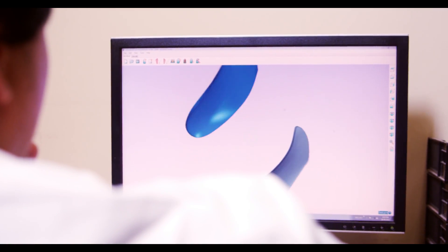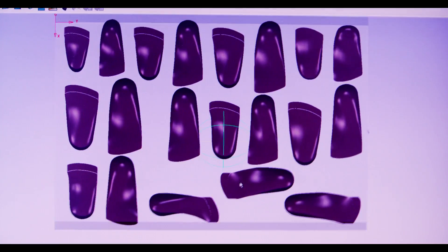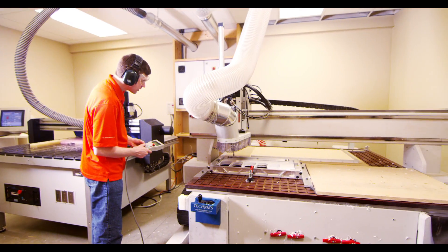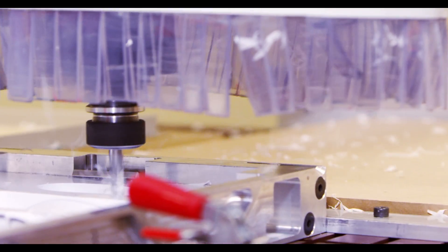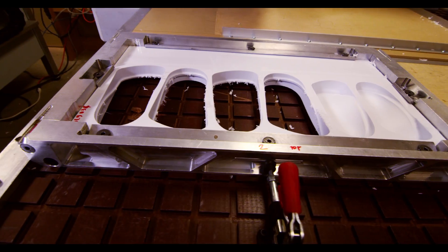For other orders, a custom orthotic is virtually created in the CAD CAM software. The shape produced on the computer is then machined directly from a block of plastic. This is called a direct milled custom orthotic. With the direct milled process, we can vary the thickness of the orthotics to the precision of 0.1 mm.